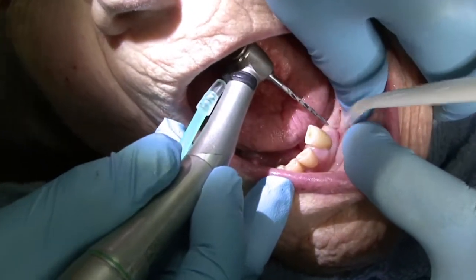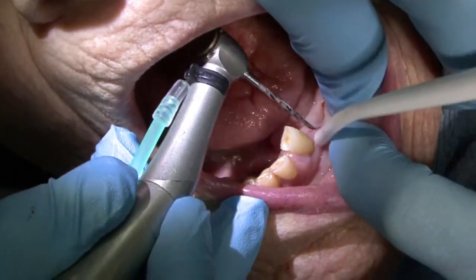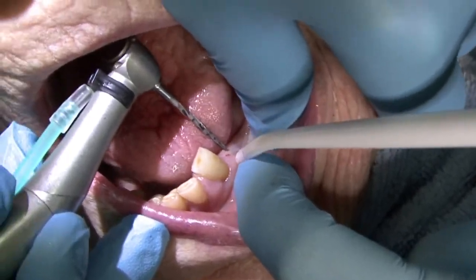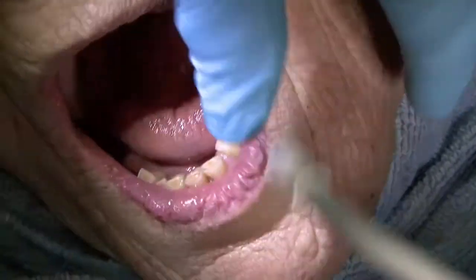So it seems like it's off a little bit there. We're going to move it again, but we've got a marker, but we're going to move it closer to the middle of the alveolar ridge.